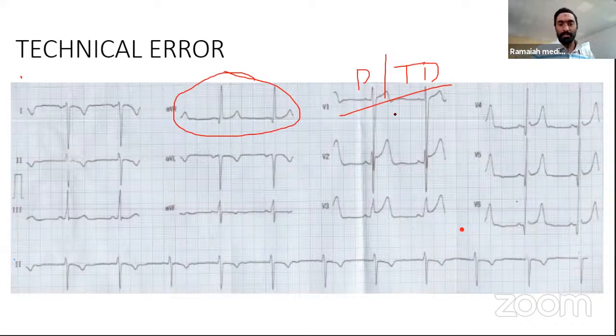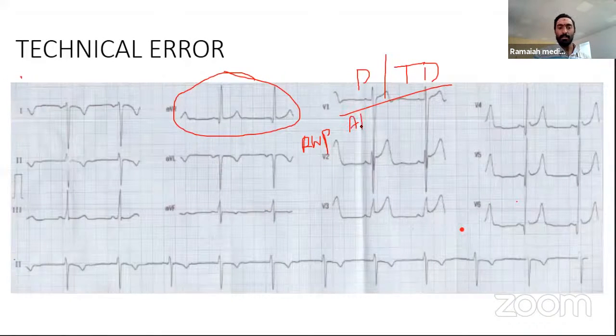Correct. So in dextrocardia, what will happen to the R-wave progression? Someone says it is going to be abnormal. What about others? What do you think? If the heart is switched to the side, normally V1 to V4, V6 are placed like this, so this is the expected direction and this will be the R-wave progression. But then it is going to be in this direction. So in dextrocardia, it will be abnormal.